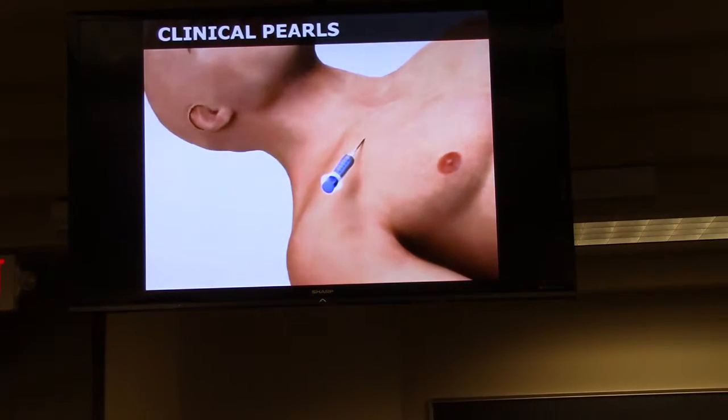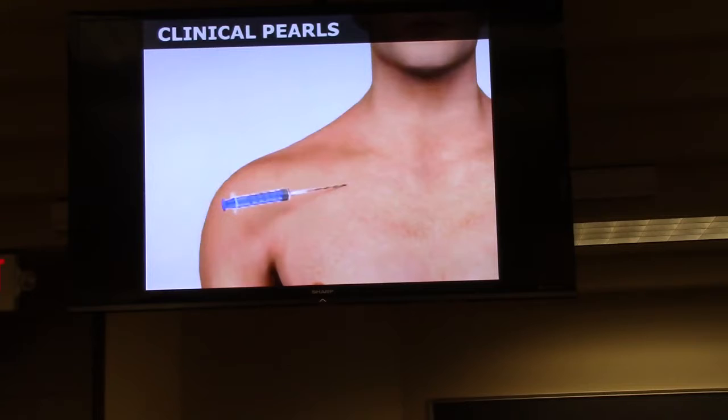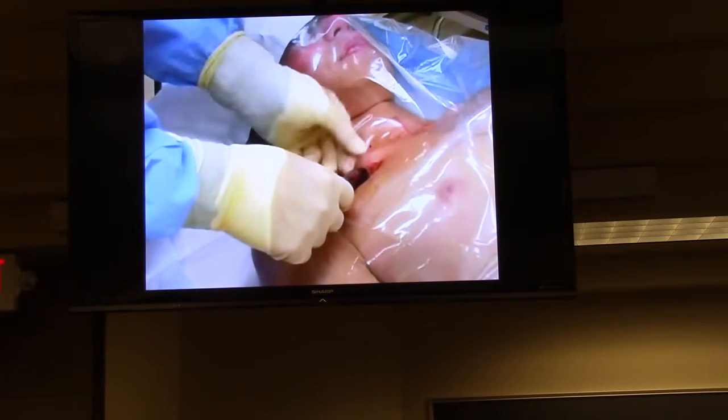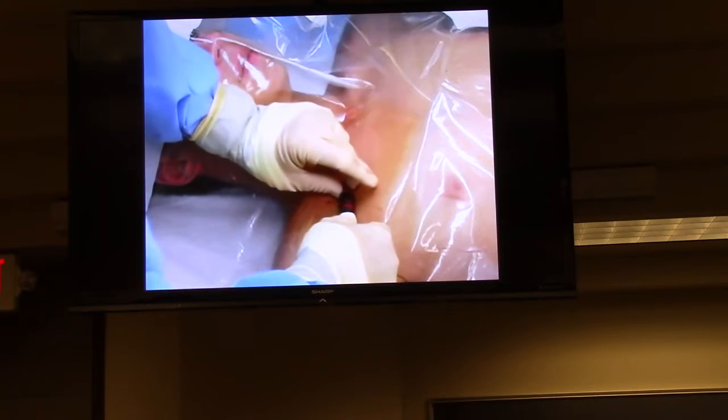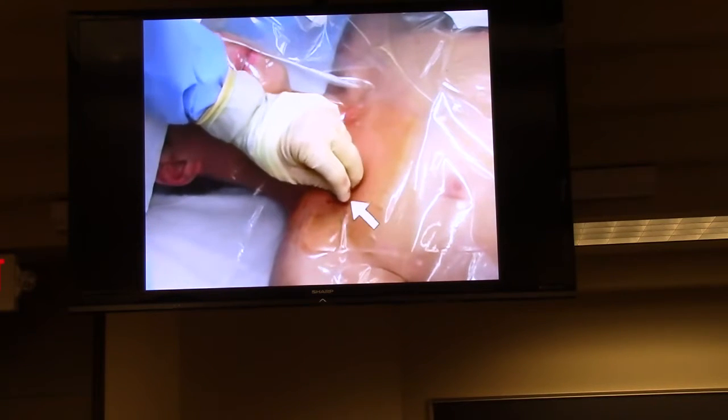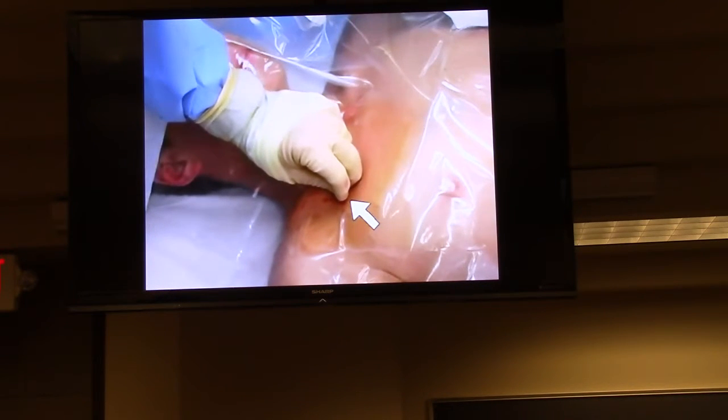If no blood is encountered while inserting the introducer needle, slowly withdraw it while continuing to aspirate. If there is no blood return, withdraw the needle, aim more cephalad, and try again. Once the vessel has been entered, secure the hub of the needle with your non-dominant hand, taking care not to advance or withdraw the needle. Remove the syringe and immediately occlude the hub with your finger to prevent air embolism.